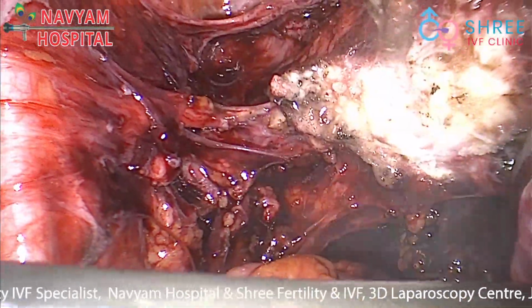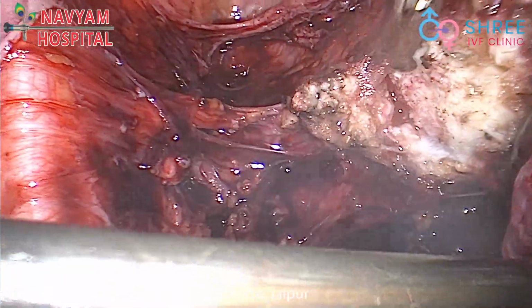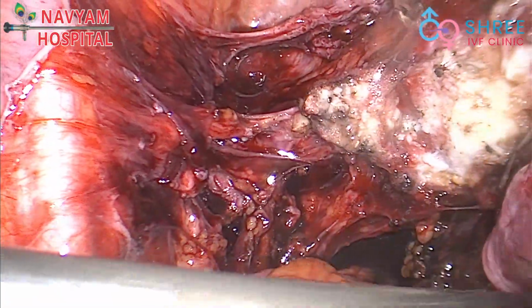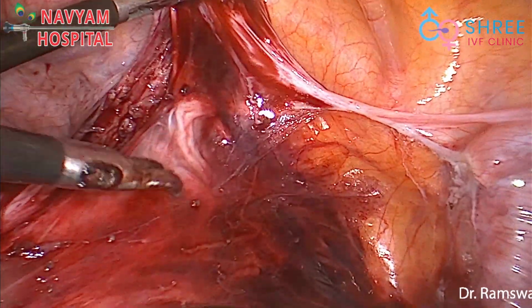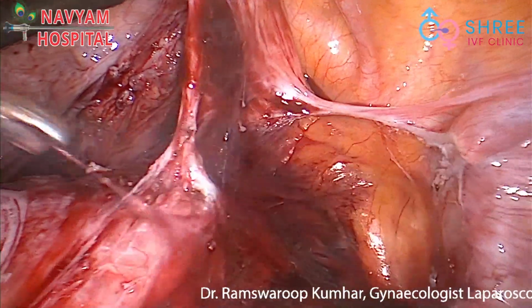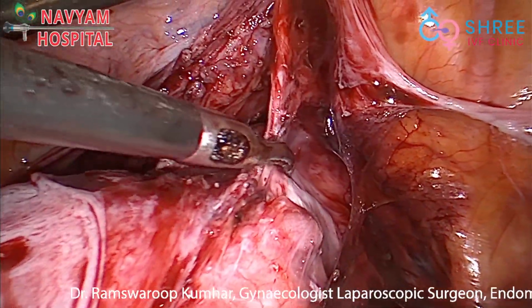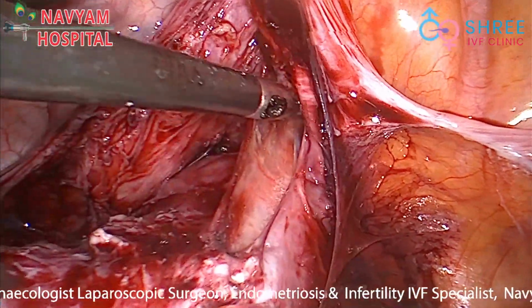Now we can see the vagina will be opened here at the insertion of the uterosacral ligament. Before opening the vault, we have to dissect on the right side also. So the whole bladder was stretched up and some more dissection was carried out on the right lateral side.